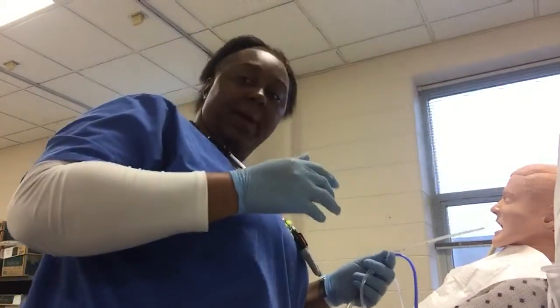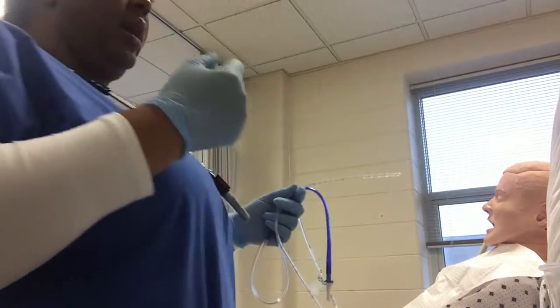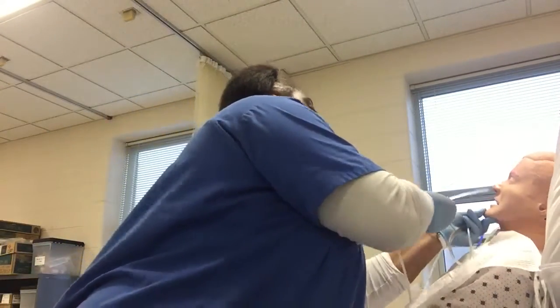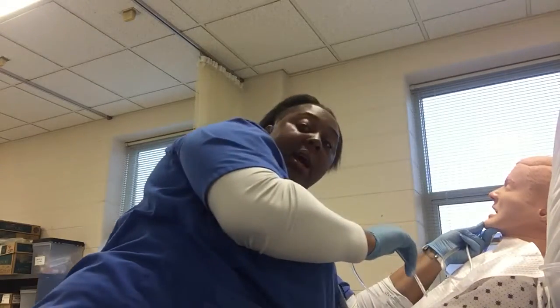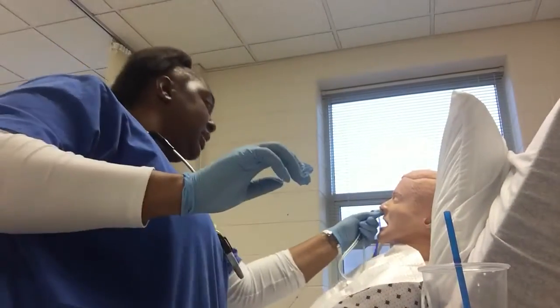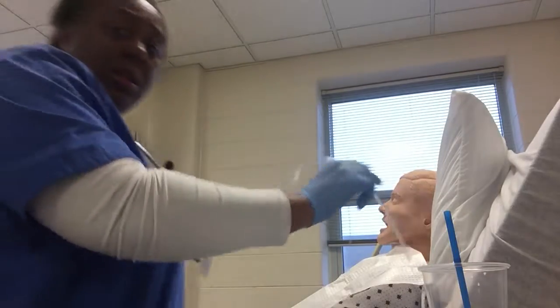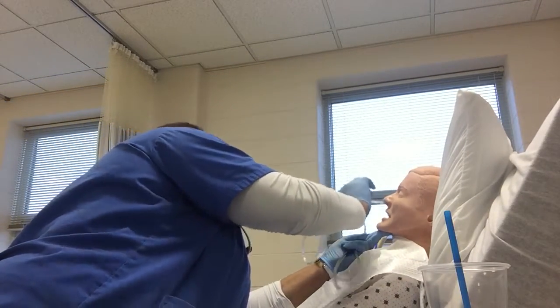I will ask the patient to hyperextend their neck, so that it's an easier flow going down. Patient hyperextends their neck. Well, I have to assess the patency of their nares to see which one will be best to go into, and we're going to use the right nostril. So that's hyperextend the neck.